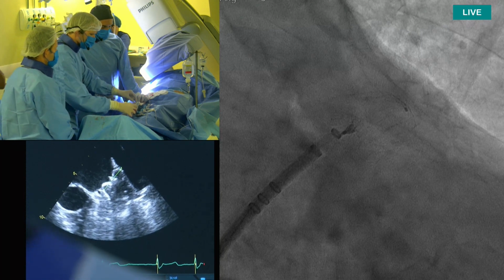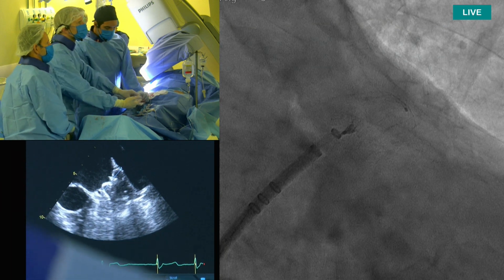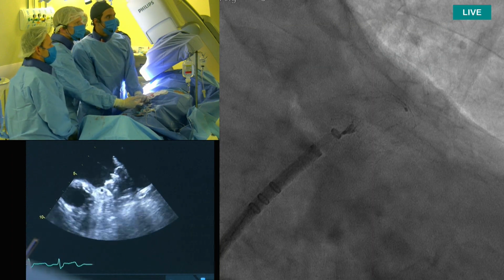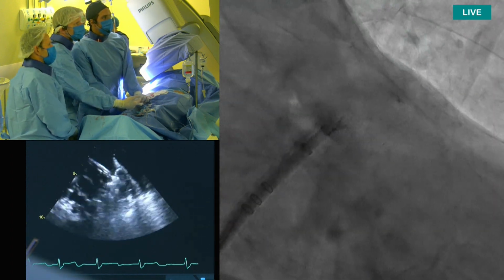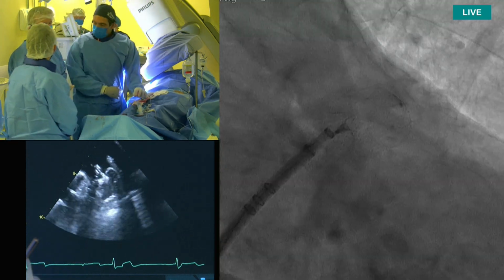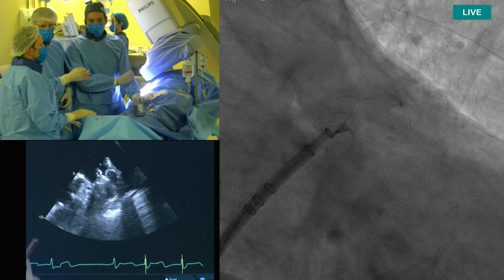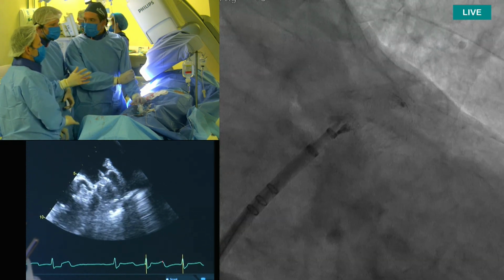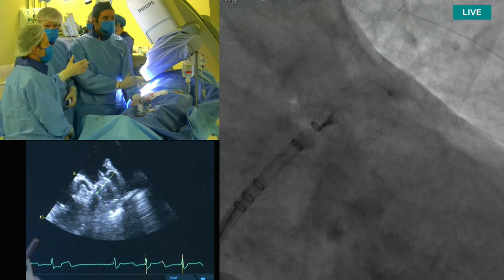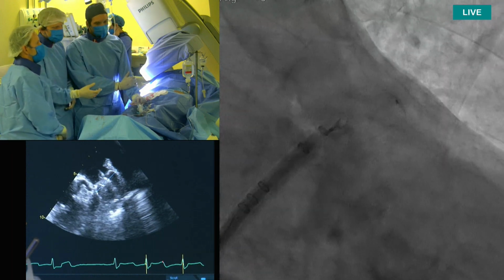Okay, let it bleed a little out there, yeah. Okay, I think we fill first the sheath, let's do that before we do a cine. Yeah, we can close this one. Yeah, we do it. I do a tug test normally, yes. But sometimes, especially if it's a patient with renal insufficiency, I would not give contrast right now yet. I would already do the tug, etc., and only maybe give a final injection. But now, if I remember well, the patient did not have renal insufficiency. No, no CKD. So we could, just for educational value, do an angio now, do the tug, and repeat it. Yes, okay, we could do that.